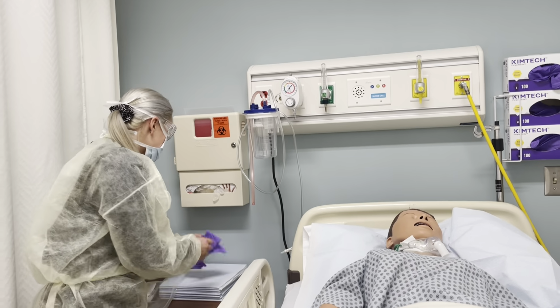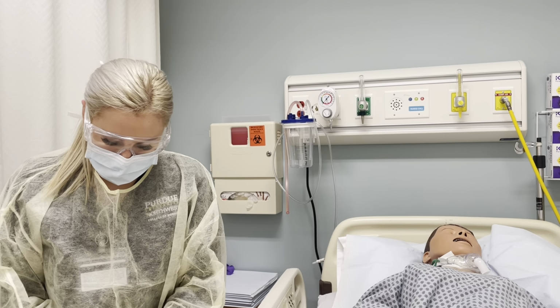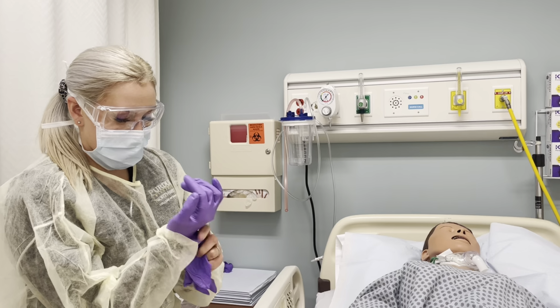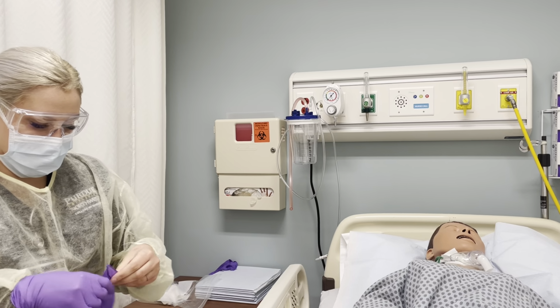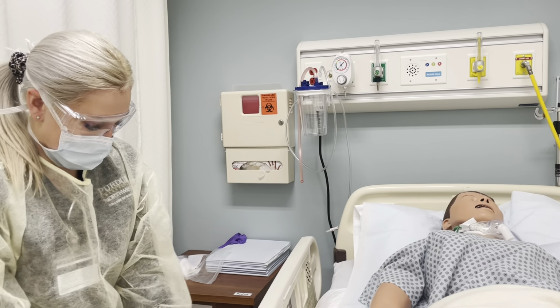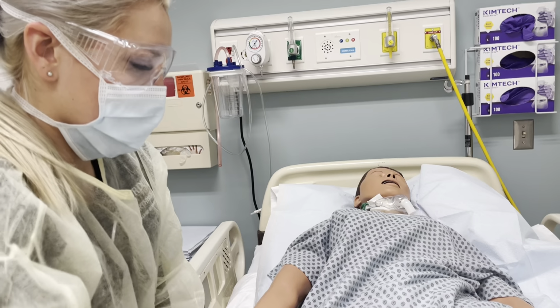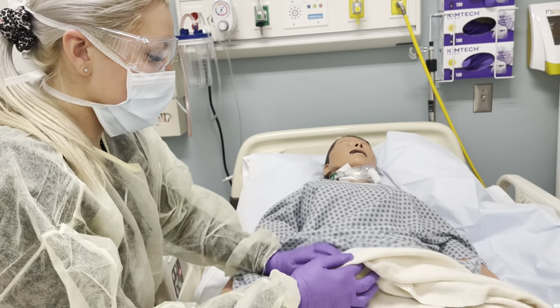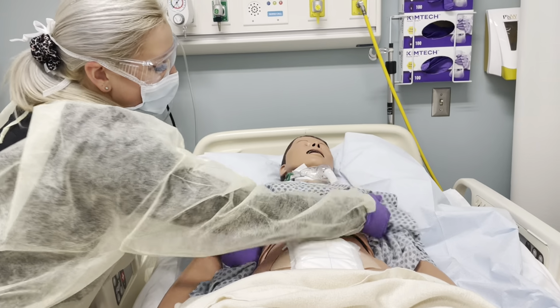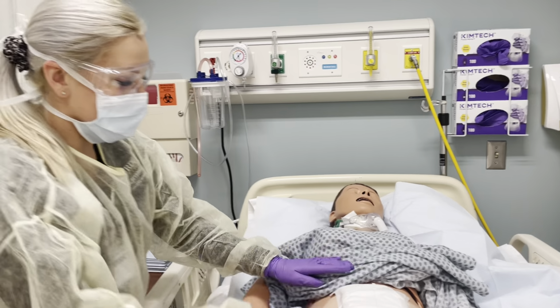Okay, I'm going to put on my gloves. And I'm going to expose the wound, making sure they stay covered. All right, I'm going to identify any tubes or drains. There are none.